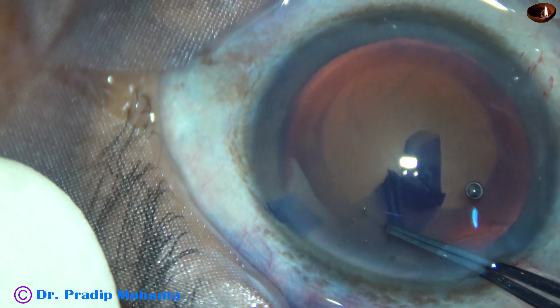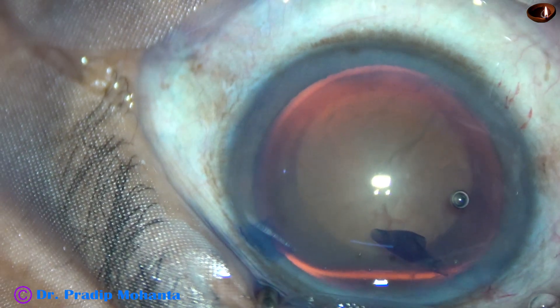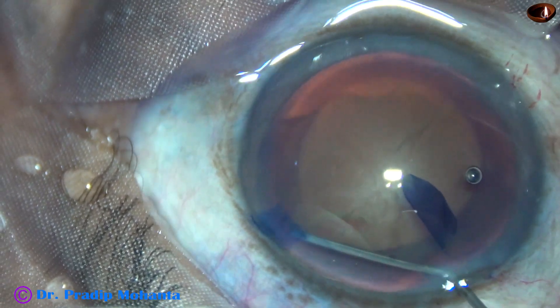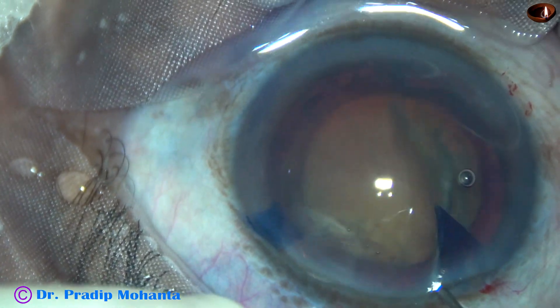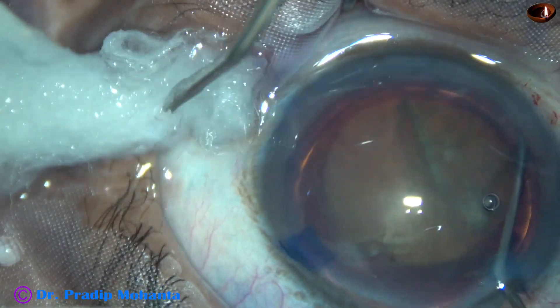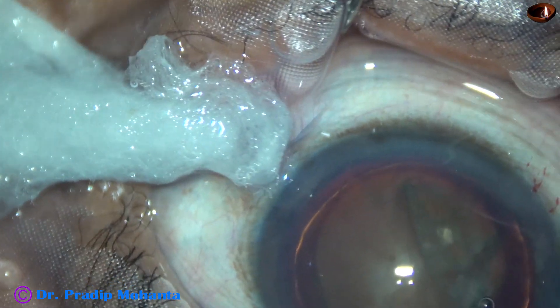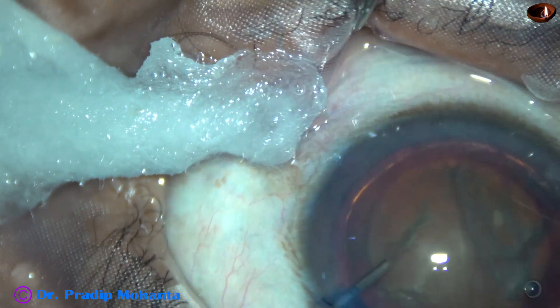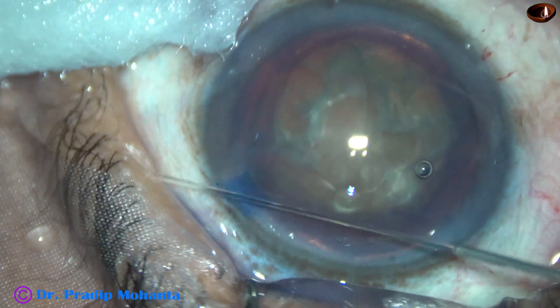This is the left eye, so I am using the supranasal aspect for doing the surgery. My assistant is applying a wick of cotton for drainage of fluid. The nuclear rotation at this stage was not good, but hydro-dissection has happened.